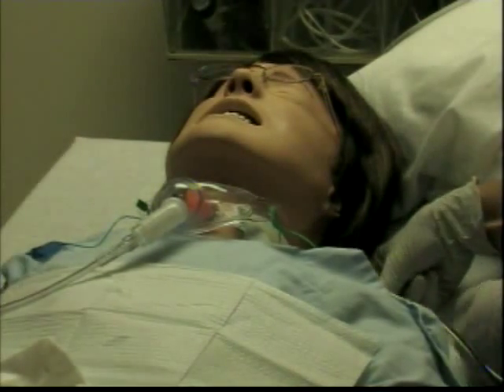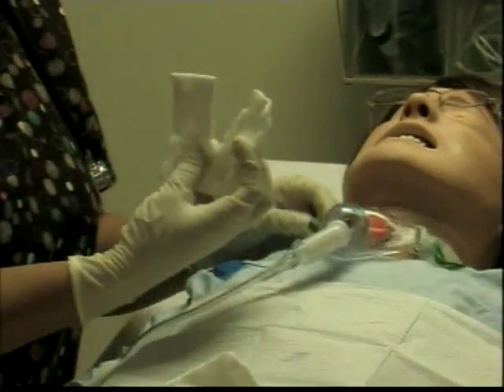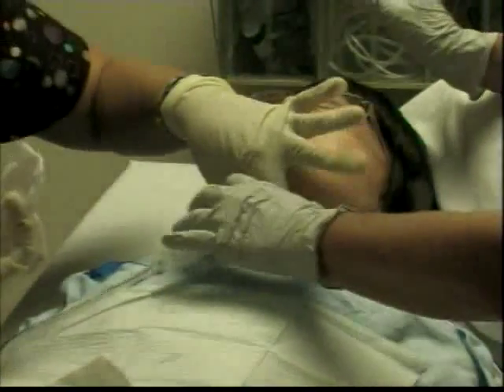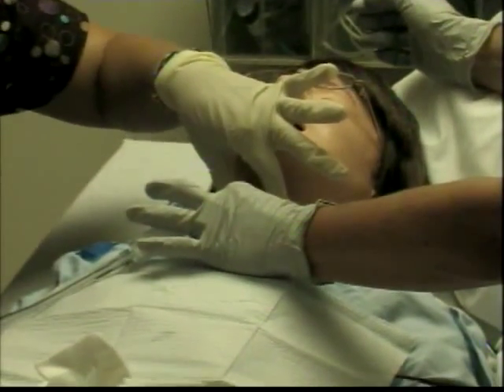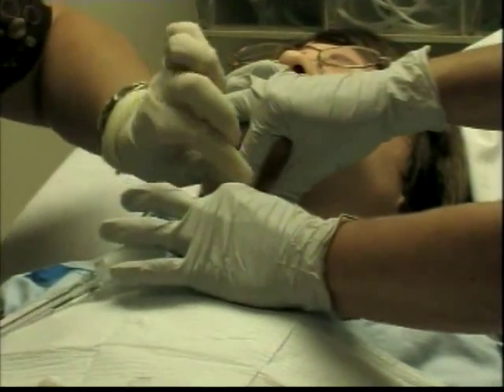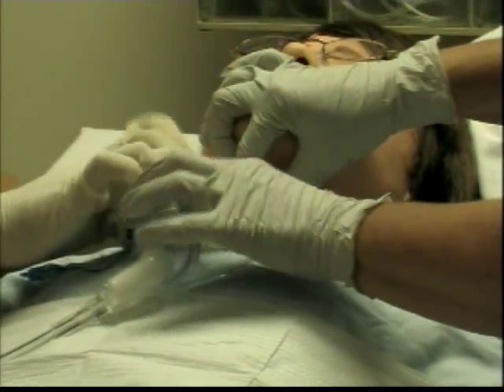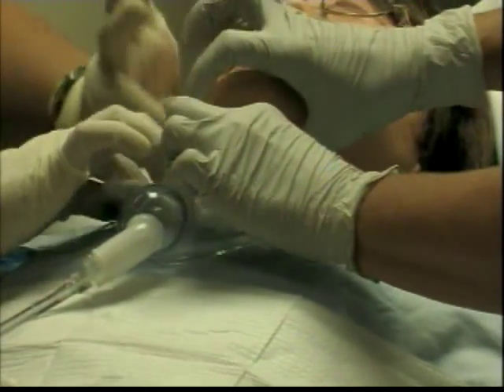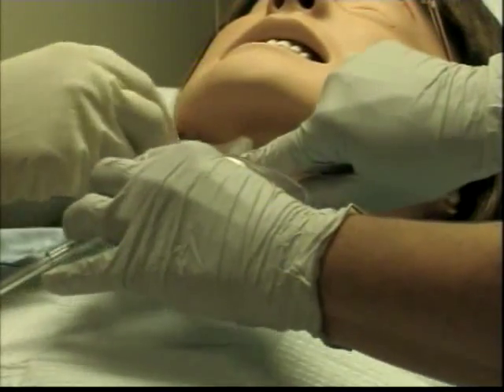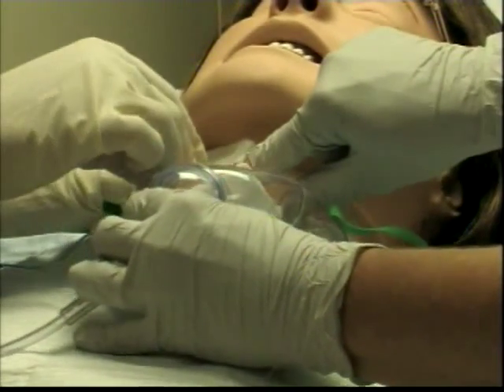Another thing that you can use at this time is your split gauze. Have it available, so you can put it in there at the same time as changing the straps. You have an assistant that can help you. The main point is that you want to maintain that face plate in place, so the trach is not going to come out. So she's doing that, and I am just going to go ahead and remove this strap from here. I will put this side of my gauze in place, and then I will replace this strap. And notice that she's keeping an eye on that, and keeping that faceplate in place.